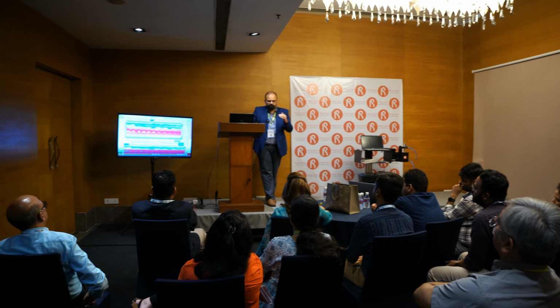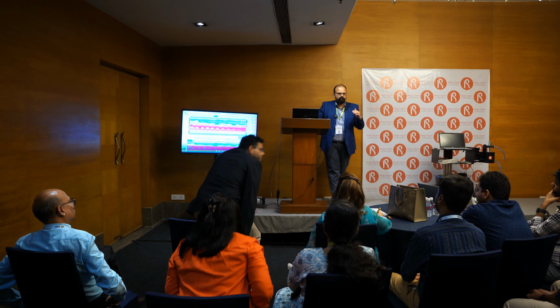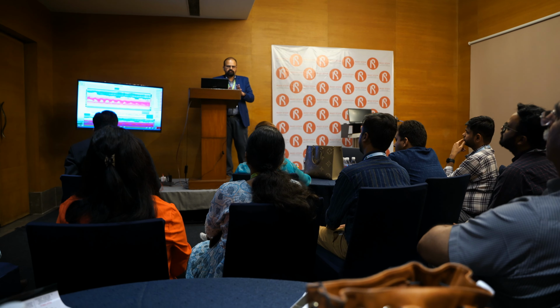Why are all these small things important? Because if we are not doing these small things right, we may not be able to give a correct interpretation when we are analyzing our reports. So you know the basic tone.